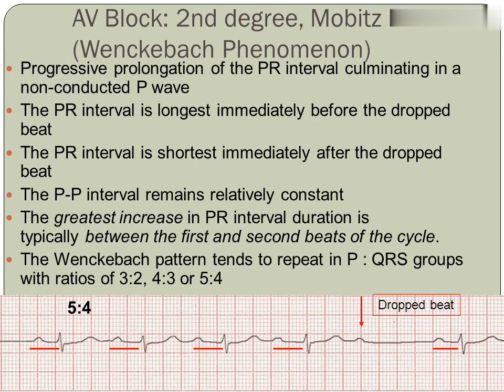Other features: the PP interval remains relatively constant. The greatest increase in PR interval duration is typically between the first and second beats of the cycle.